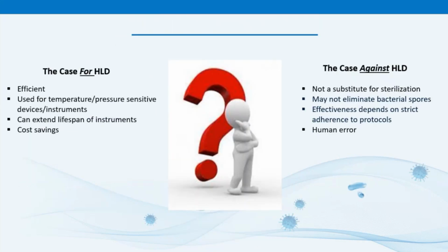With all of these challenges, why do we even use HLD? Those in favor of HLD emphasize its efficiency and practicality, especially in high throughput healthcare environments where sterilization isn't required. This is because, of course, the time required for HLD is typically less than that for sterilization. And this can be crucial in situations where quick turnaround times are essential.